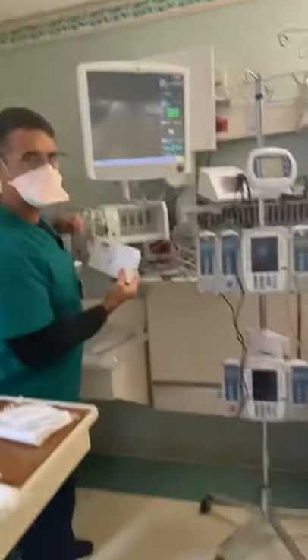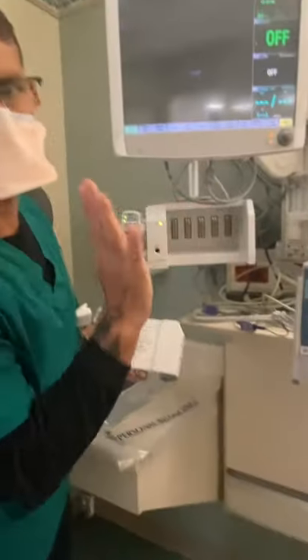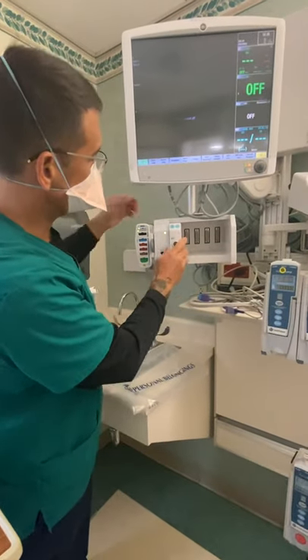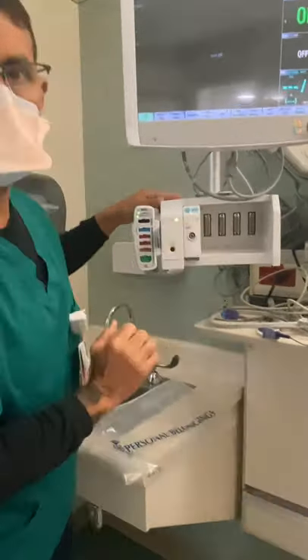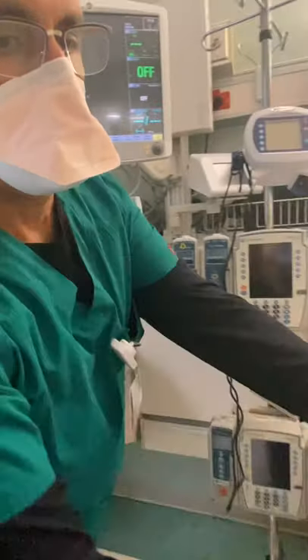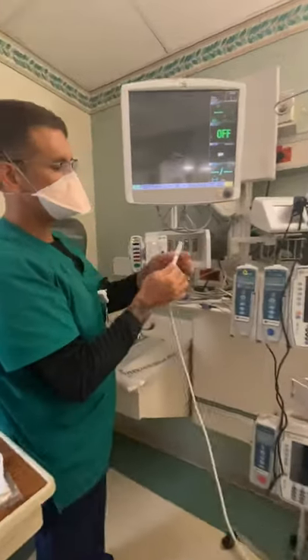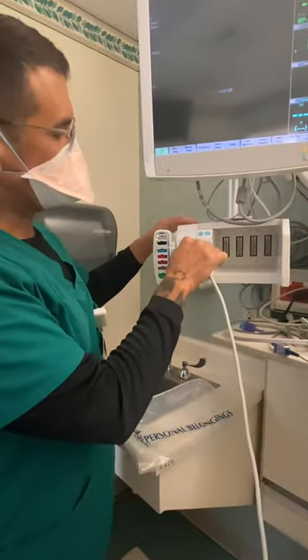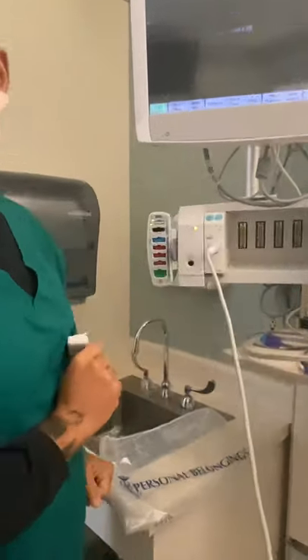I know that some of you think that this is storage, but it's not storage. That's what this is for, for the modules. So you fit one of the modules in there. It slides right in. Make sure it clicks, and you're ready. You take the connector, which can only go in one way. It has a little ridge that faces up. Click it in, and you're good.